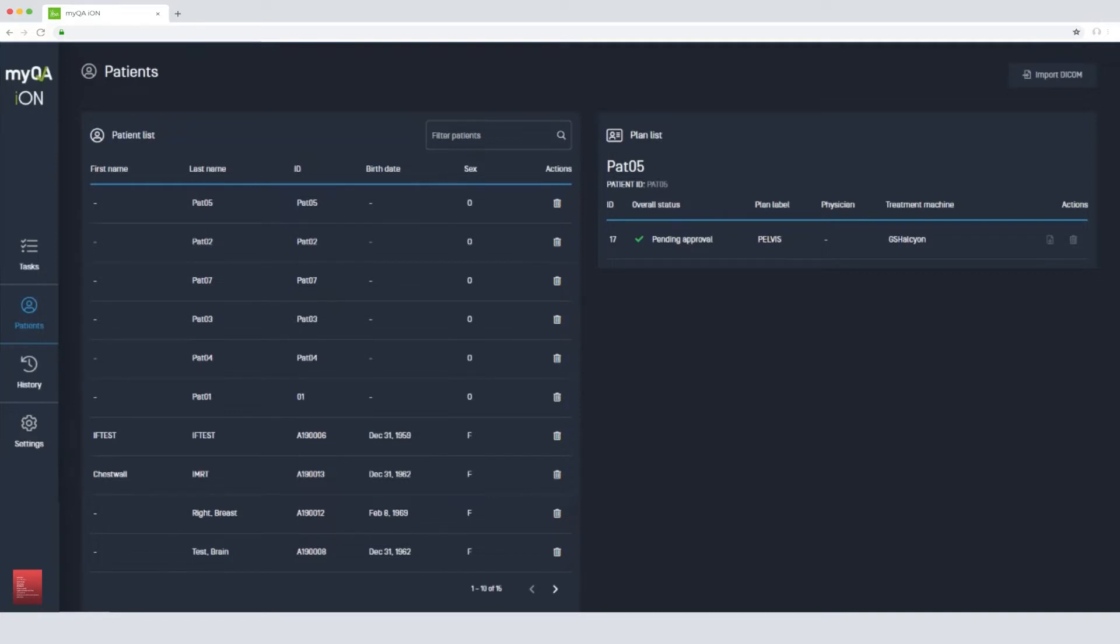Here we can see which patients need approving, which QA plan has been rejected, and which patients might need more data.